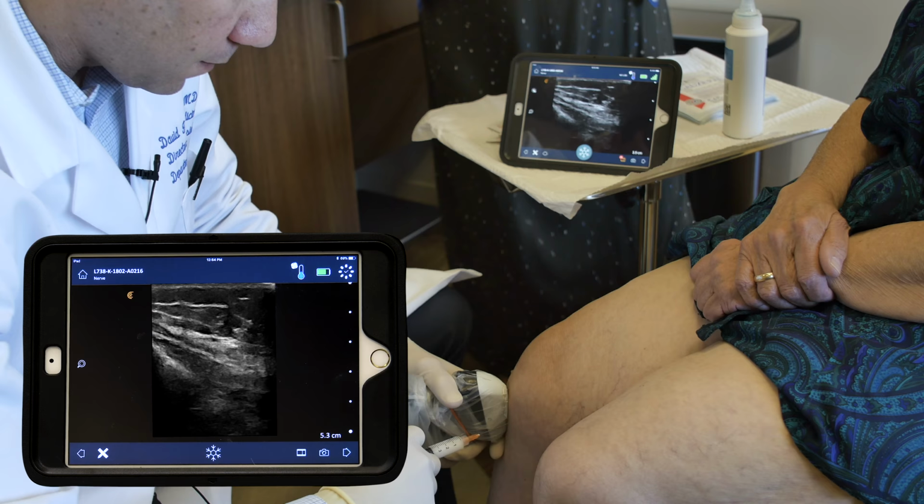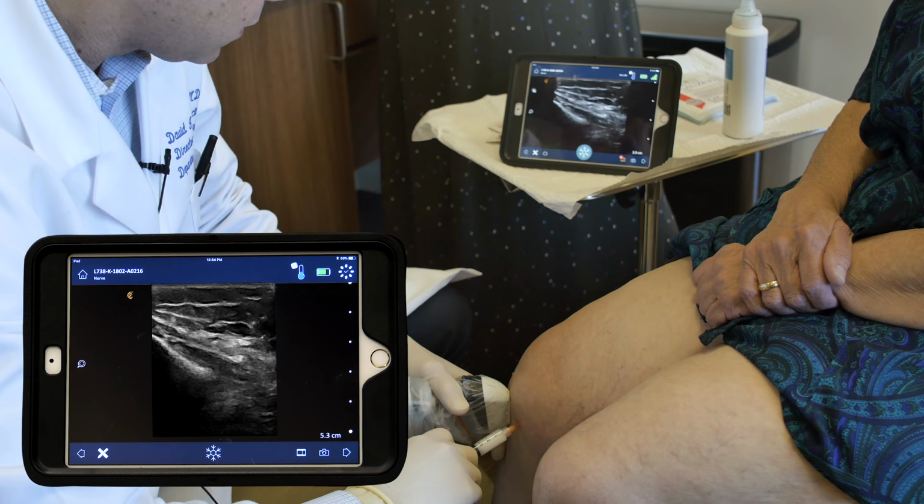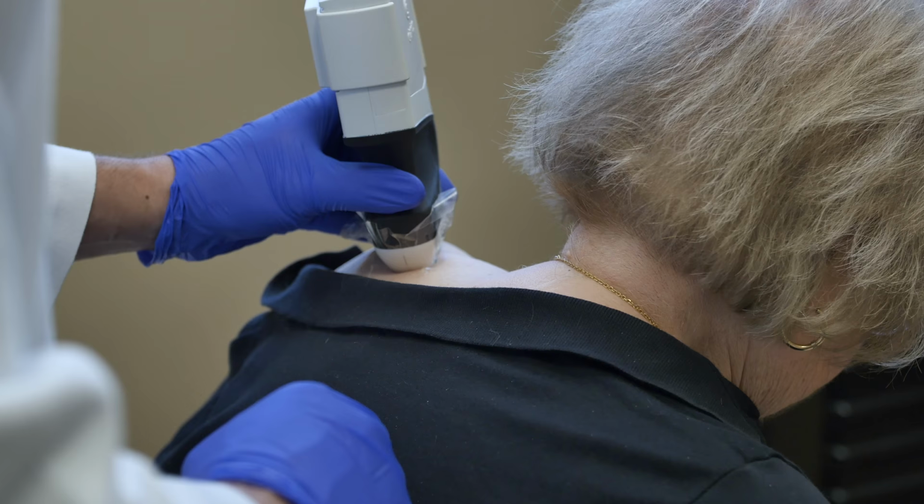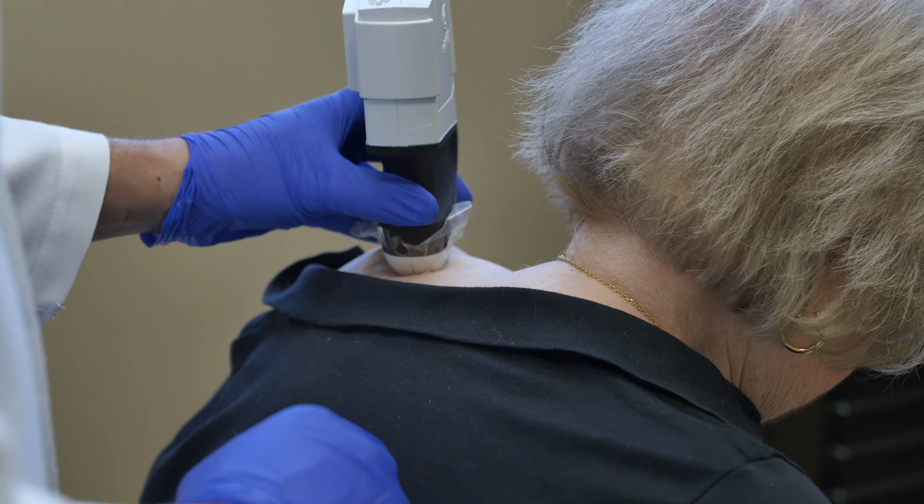Many of my patients have first seen their primary care doctors, physical therapists, spine surgeons, orthopedics, and still have not found relief. Ultrasound enables me to safely and efficiently find the nerve, muscle, or joint or tendon that I'm targeting, and I can guide a needle under the ultrasound guidance to that tissue to deposit local anesthetic, steroid, or some other medication next to that tissue.